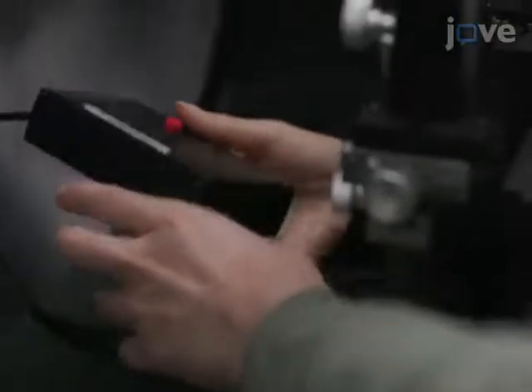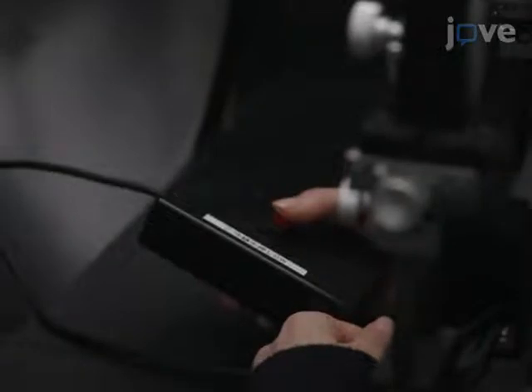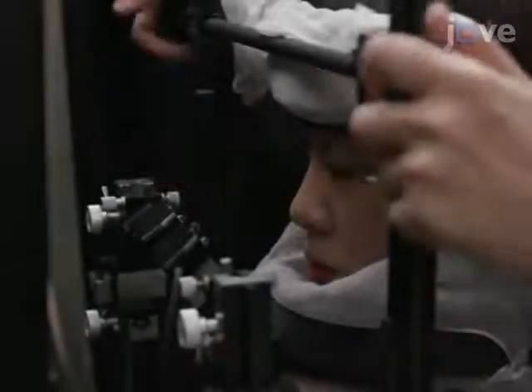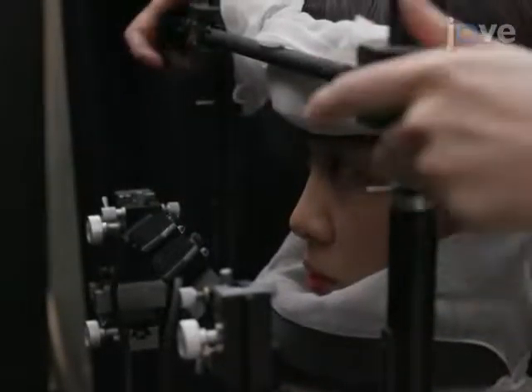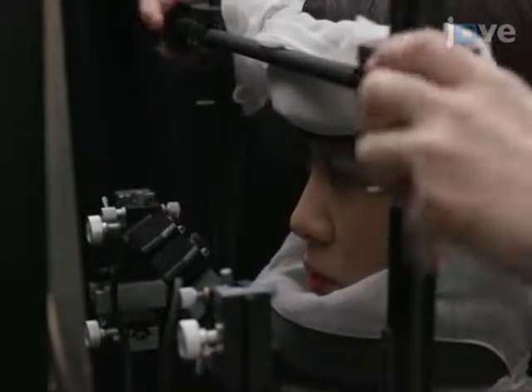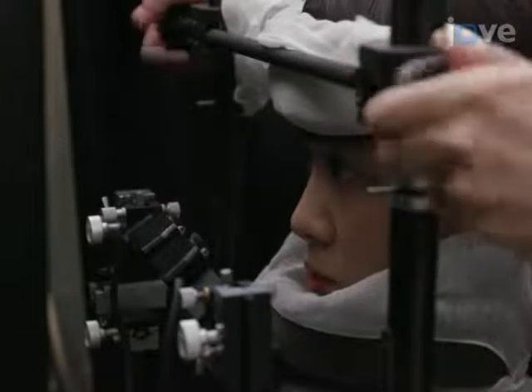Then provide the subject with a micro-switch button connected to a microcomputer, which allows them to initiate and terminate a task trial by pressing and releasing the button. Stabilize the subject's head position by chin and forehead rests, as well as by a headband.